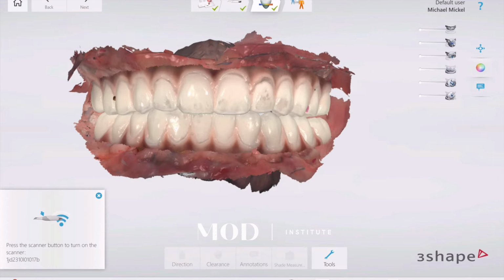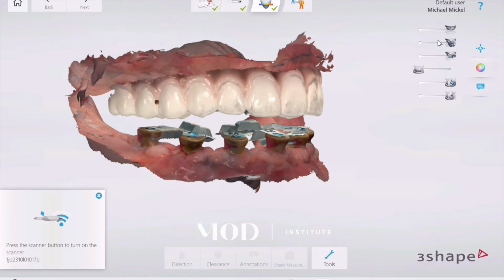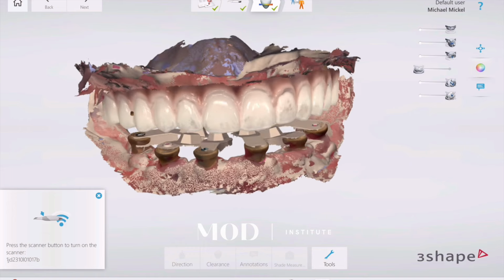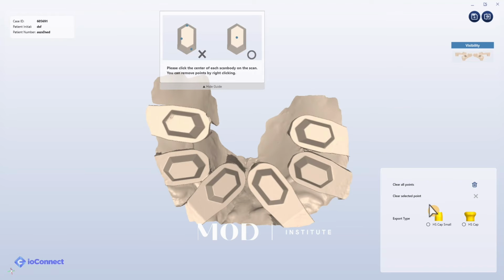And so now in this software, I have my pre-op prosthetic. I have that aligned to the upper and lower arch. I have my soft tissue scan caps and my scan bodies all aligned in space. And this could be sent off for final prosthetic design. So now you could do this, or the lab could do this.